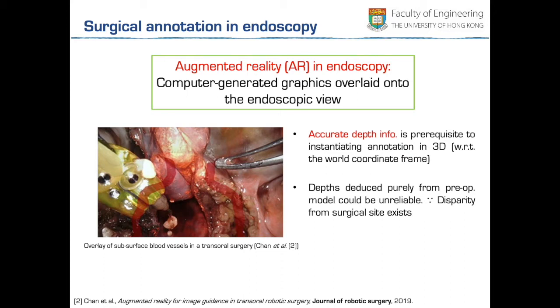In usual surgical AR, preoperatively segmented and reconstructed 3D anatomic models are registered to the surgical scene, which may then be used as reference surfaces to read depth information.